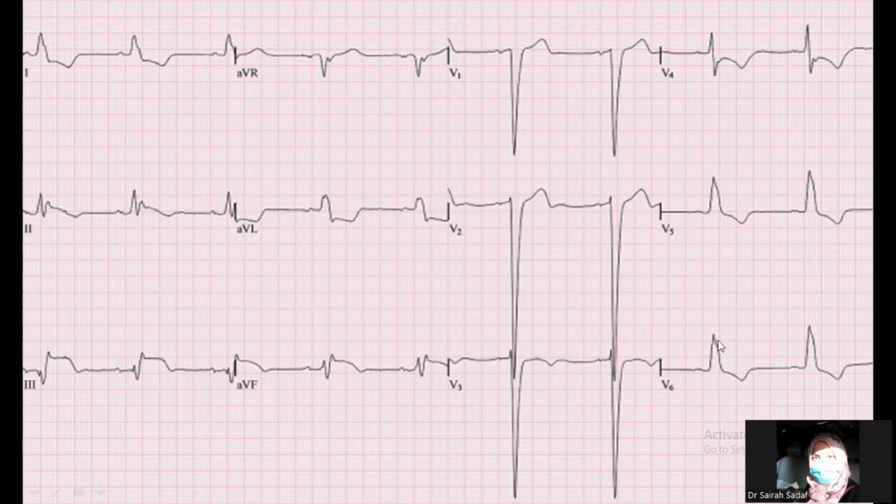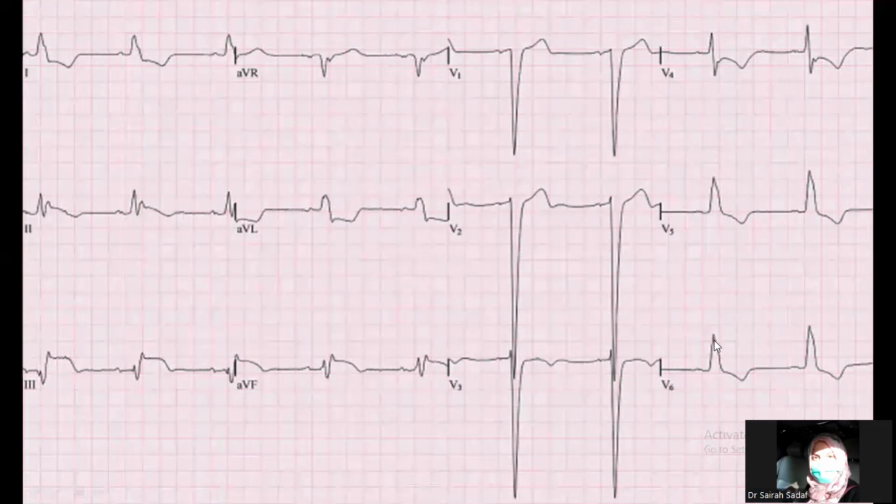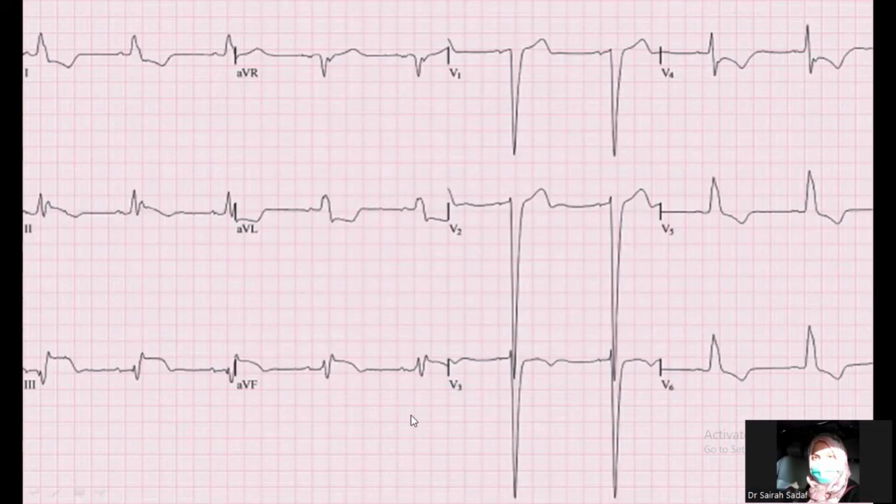This is the slurring I was talking about. As you can see, this is the slurring. Okay? So this is LBB. Very good. LBB, good. Okay, Safiyullah is also here now. Yes, Saima, you are right.